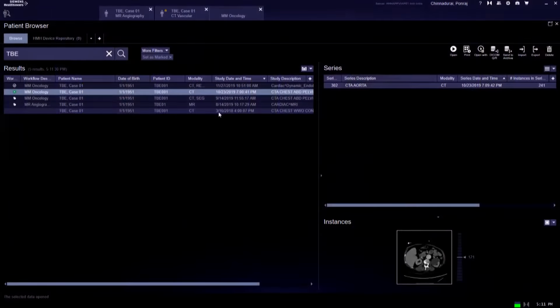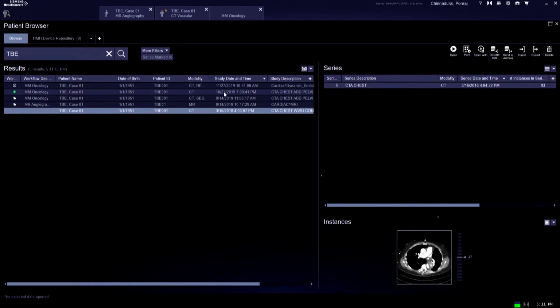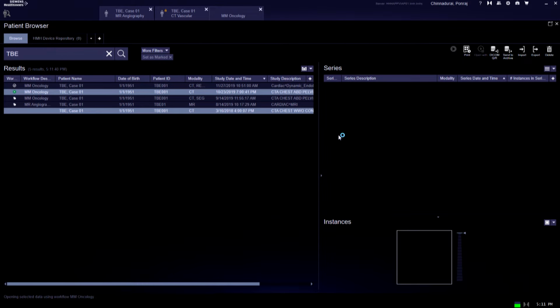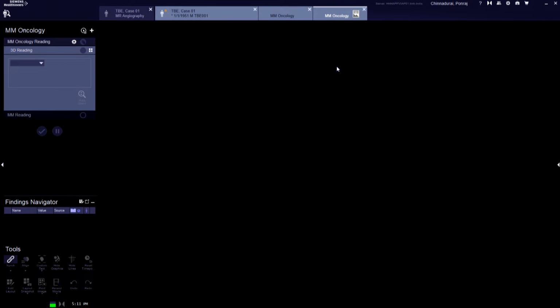So what I'm going to try to demonstrate, hopefully it works, is, for example, this patient had a CT study from 2018 and 2019 that you're seeing here. I'm going to try to select both the studies and say, okay, I want to compare using one of these workflows. So what you can see in real time is that the algorithm knows where exactly the known anatomical landmarks are, such as clavicle, sternal notch, iliac crest, and then it tries to put it all together and match it. And what you're seeing here is it's trying to load the data set right now.